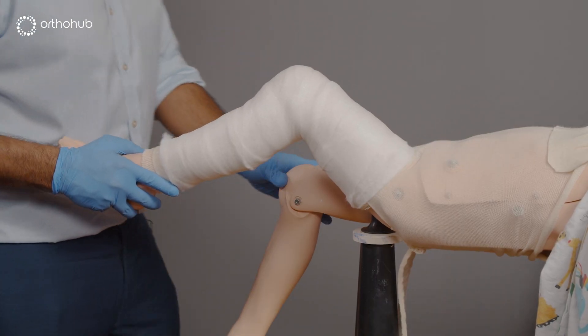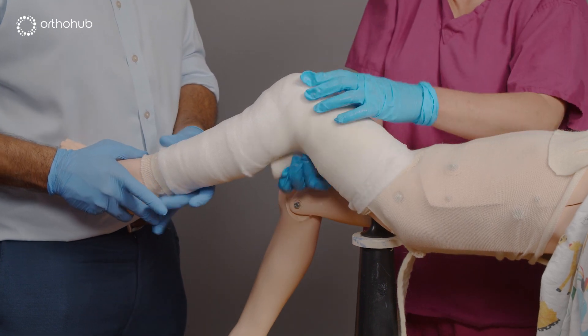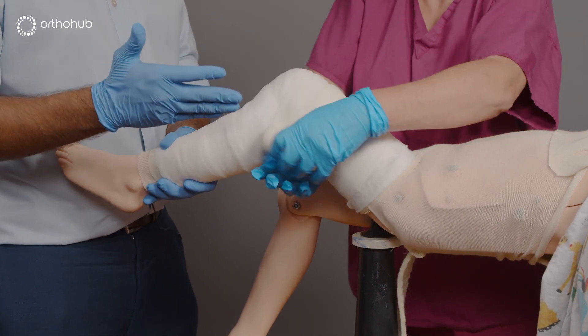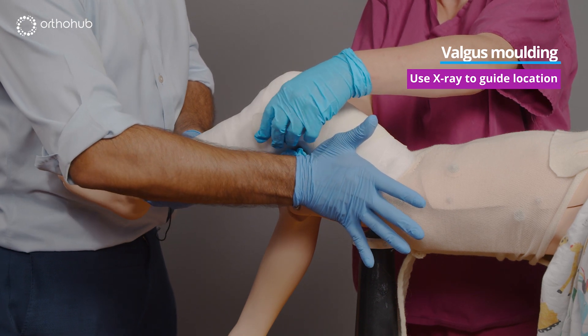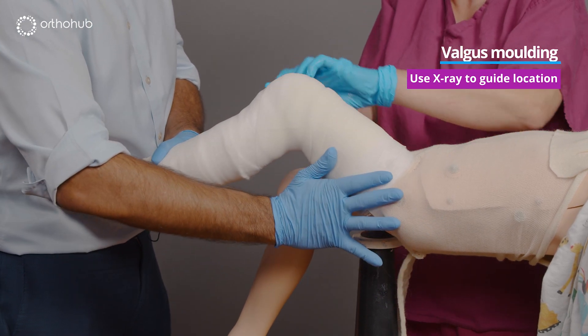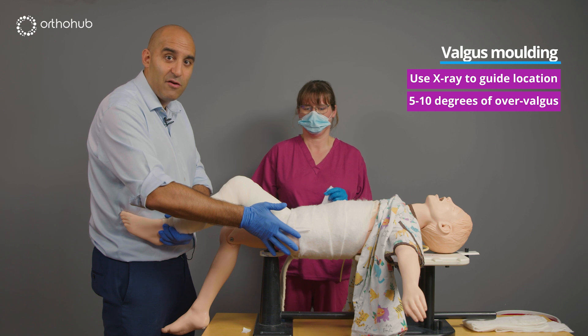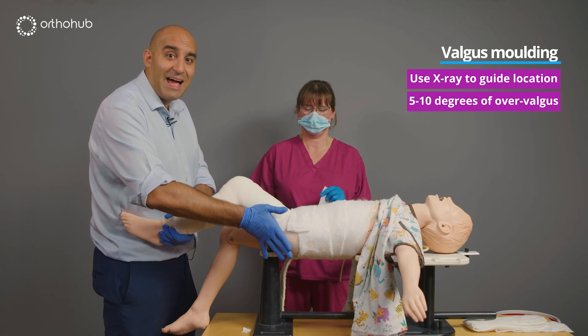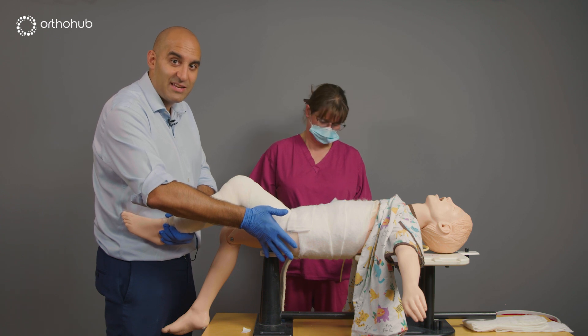We apply our first layer of scotch cast, and once we've gone past the level of the fracture site, we start applying a valgus mould at that level. I tend to apply a slight over-valgus mould, looking for around five to ten degrees, understanding that it will tend to drift into varus. In my experience, the cases where I haven't applied sufficient valgus mould are the ones I've needed to wedge at ten days.